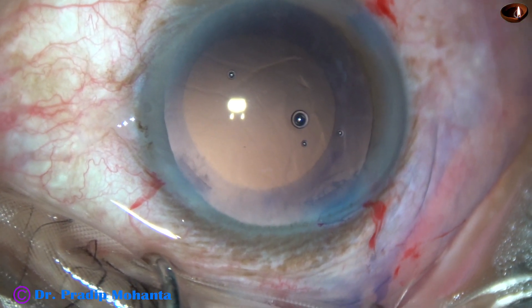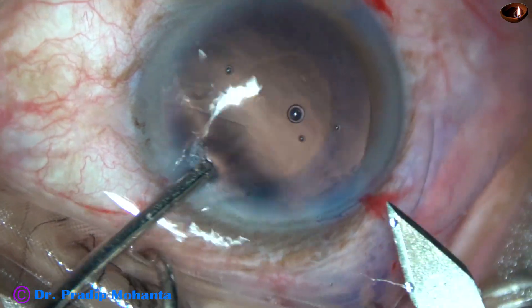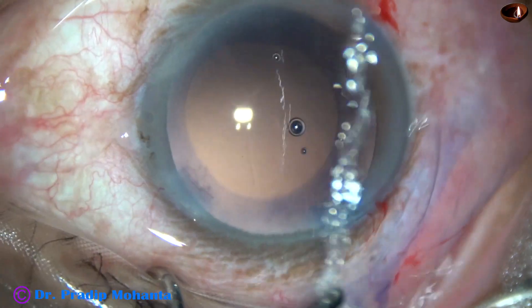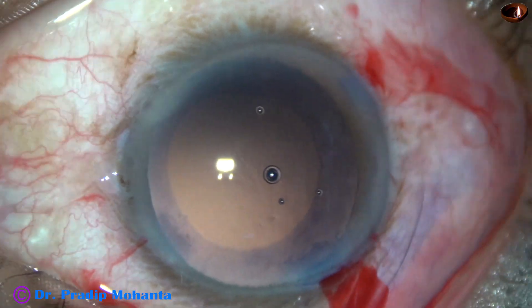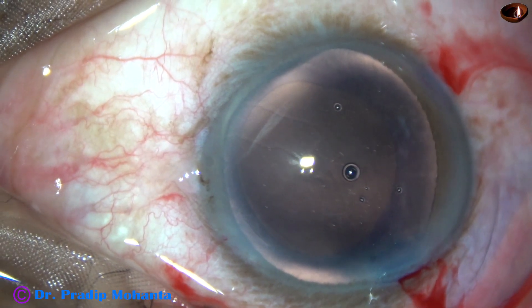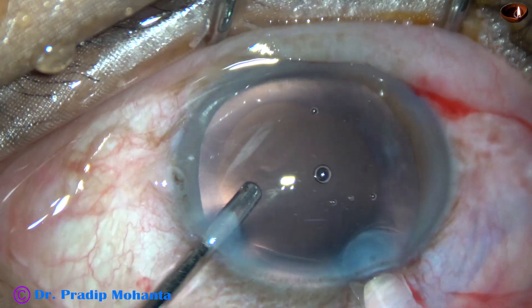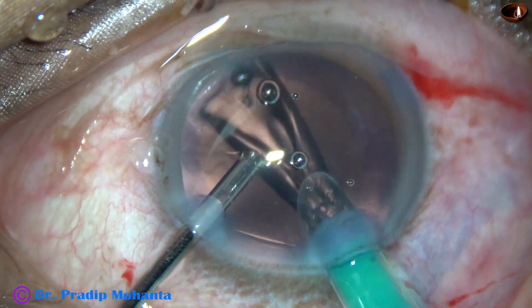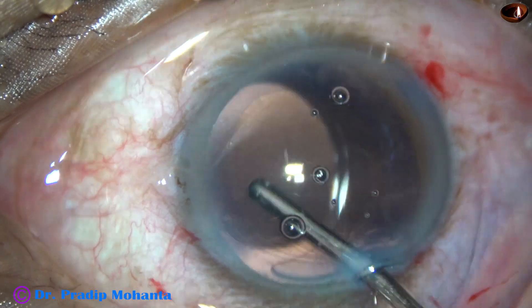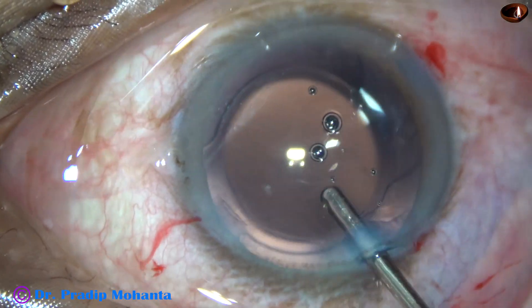And now, this is the time to implant an intraocular lens. The patient could not afford a hydrophobic intraocular lens, so we are implanting a hydrophilic acrylic monofocal intraocular lens. This is hydro-implantation of the lens. Whatever visco is there in the capsular bag can be displaced. Irrigation keeps the anterior chamber formed, and the lens goes into the capsular bag.